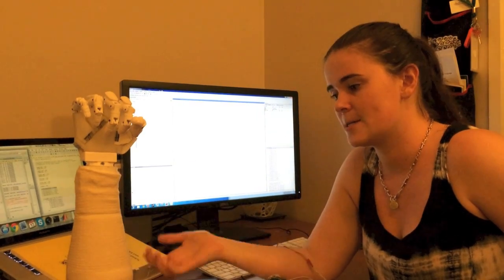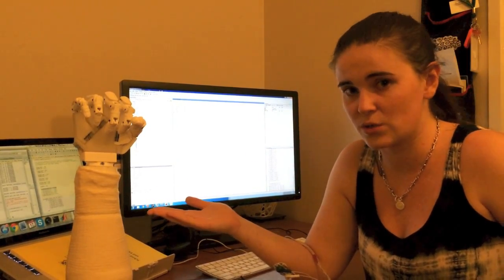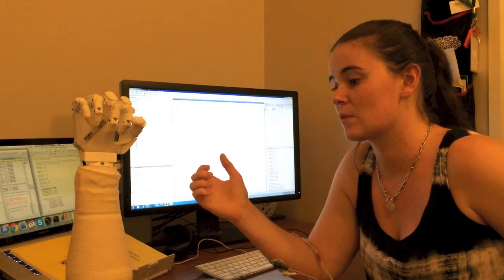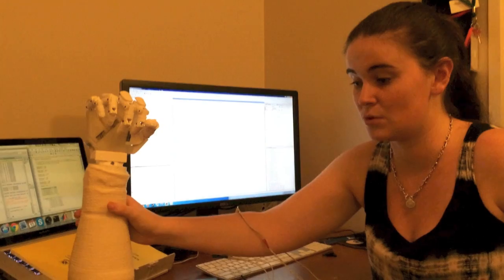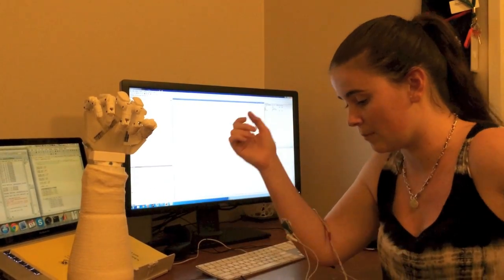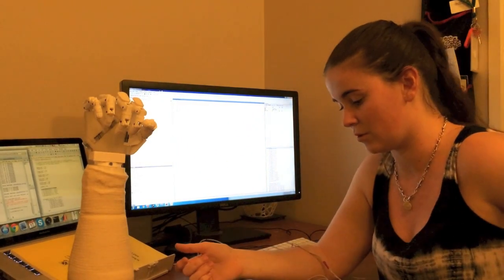So some obvious things, the hardware. This isn't suitable for someone with a prosthetic to use. It's not designed for that. It's purely a medium for me to be able to demonstrate what I can do. This is also not very practical for someone with a prosthetic.